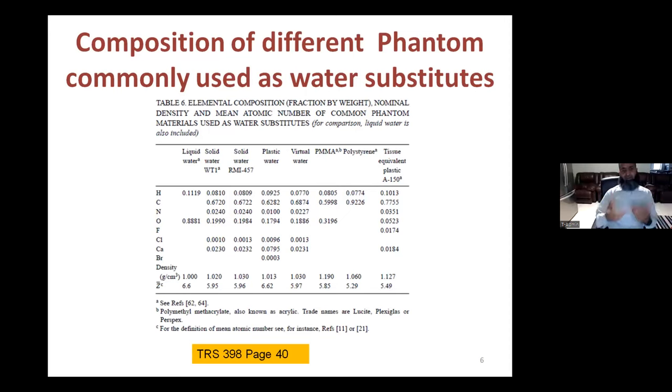And then this is basically called a fudge factor, if you want to do it. But there are a lot of issues with the other things, especially when you're doing electron dosimetry. You can't get the precise depth, which is a Dmax. For example, if you can only go up to 1 millimeter and your depth is 1.54 centimeters, you can get only 1.5, you can't get 1.54.